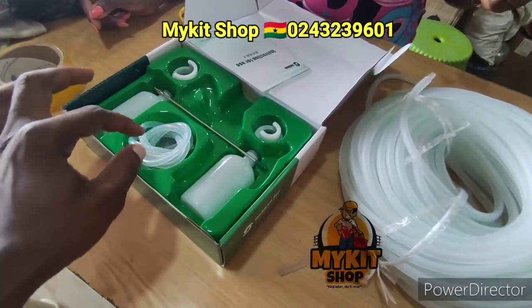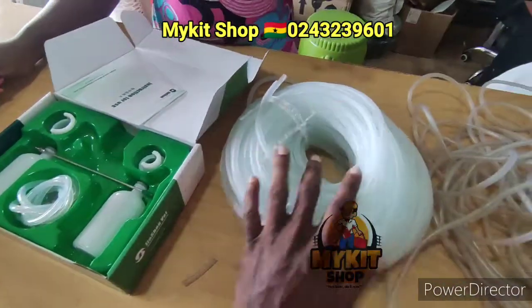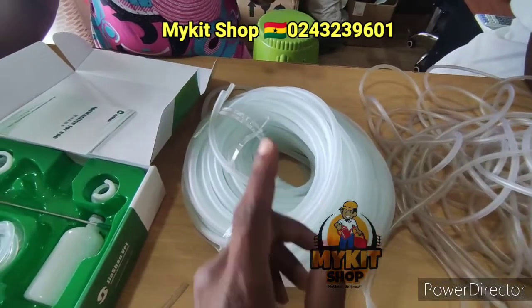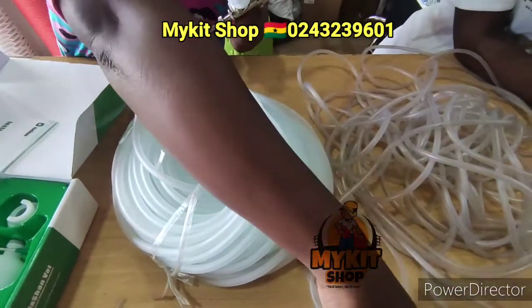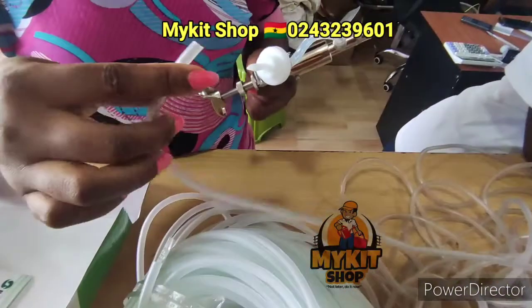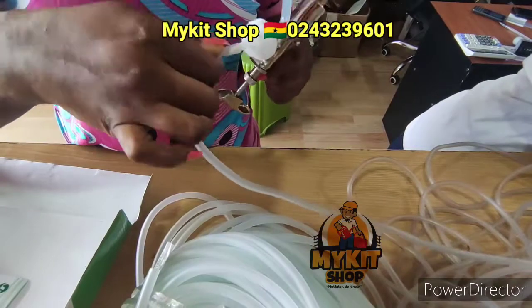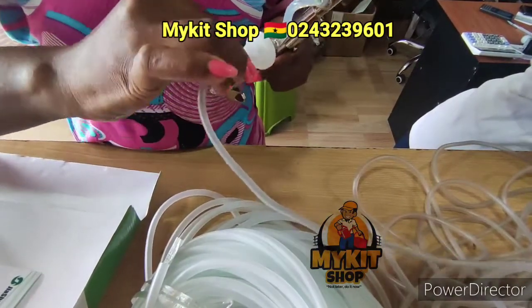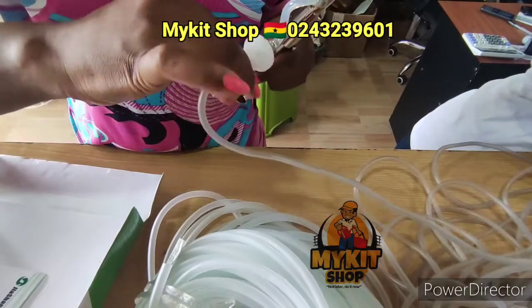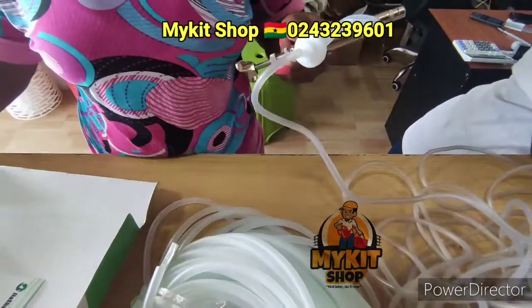It's advisable to change your tube after every vaccination. We have extra tubes you can buy. The 4mm tube fits in very tightly. You can visit my kit shop if you want extra tubes for your automatic syringe.